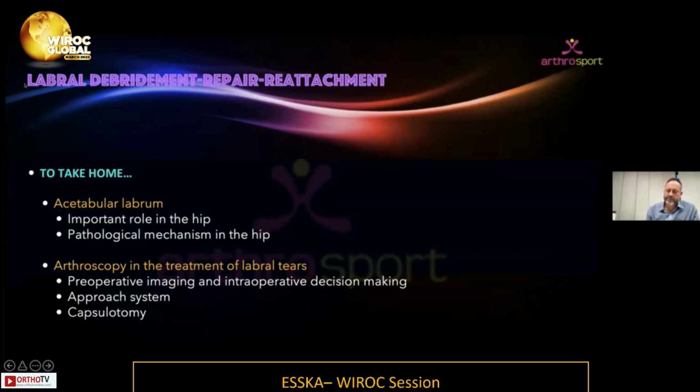To obtain a good labrum repair, the most important thing is to prepare it based on preoperative imaging and intraoperative decision-making. You have to keep in mind that the outcome obtained from hip arthroscopy doesn't depend on the approach system used. In this context, the current line is limiting the capsulotomy to be as conservative as possible to maintain the stabilizing function of the iliofemoral ligament.